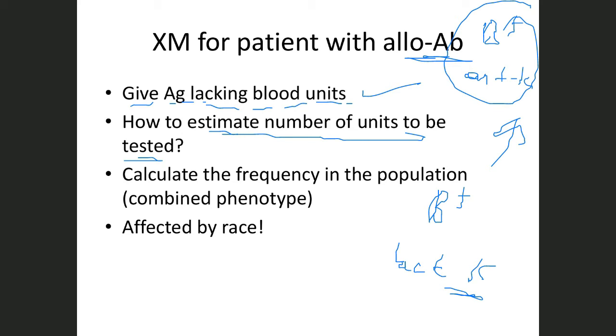If a colleague takes out a blood unit and puts it beside her, and works for half an hour or an hour doing cross matching, then excellent, if it stays a long time the temperature goes up, isn't it? There is a chance of contamination. It becomes a little bit warm, rising from 4 degrees toward room temperature. So it increases the risk of bacterial contamination, and we don't want that. So we just take a segment and return it.